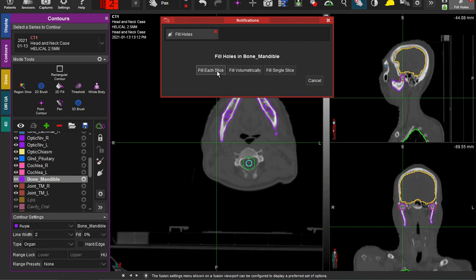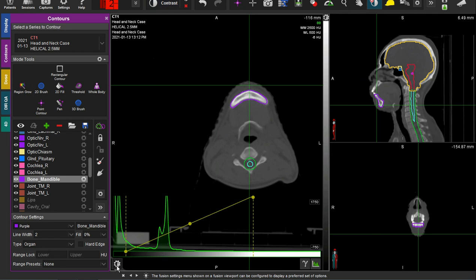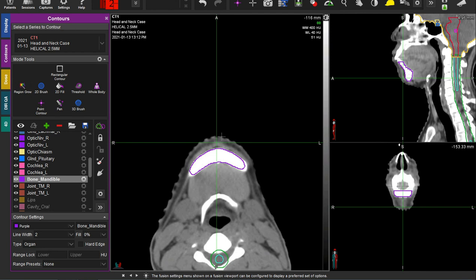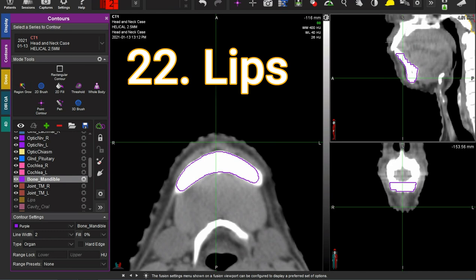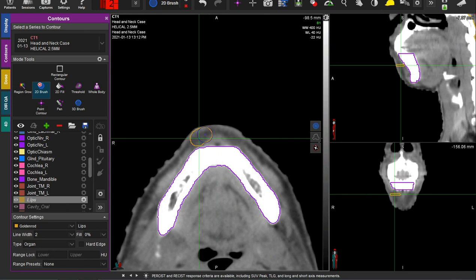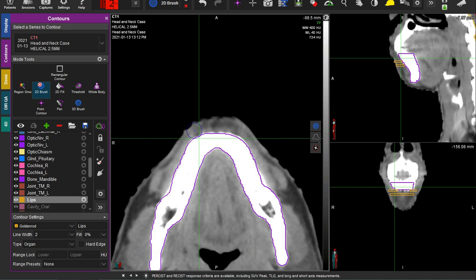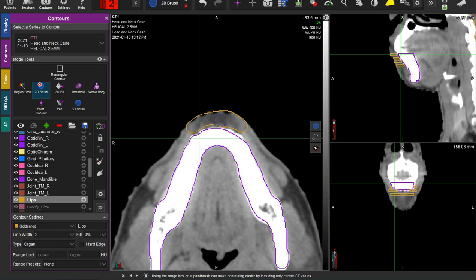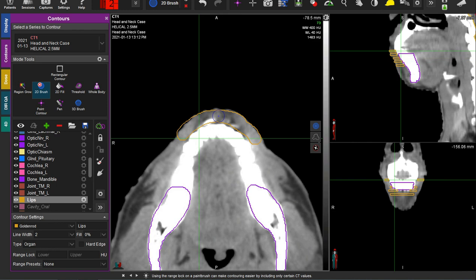I need to change the preset back to none and fill each slice. We are done with the bone window and can go back to soft tissue window. We are ready to do the lips. I look at the sagittal view to get a sense of where the patient's lips realistically are — here you can start to see how this tissue looks a little different compared to below it. Around here is where I would start to count this as lips. Lips don't have to be drawn perfectly — mostly it's for helping choose the right angles and how much dose you'll give at each angle with IMRT planning.